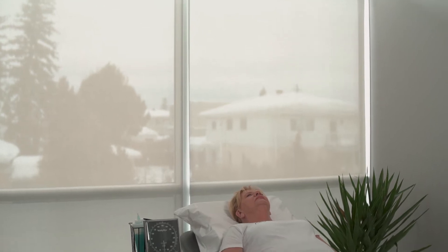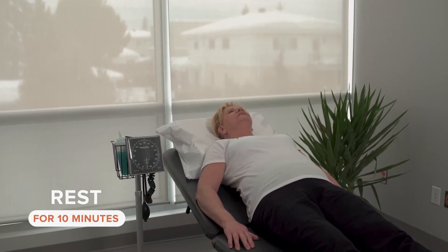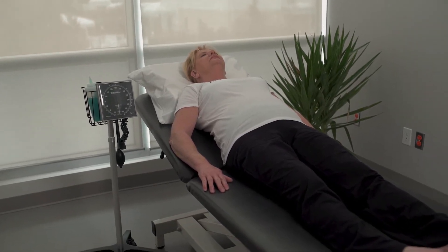Before we begin the test, Mrs. Beauchamp needs to relax in a quiet room for about 10 minutes to stabilize her blood pressure. There are three steps to obtain an ankle brachial index.